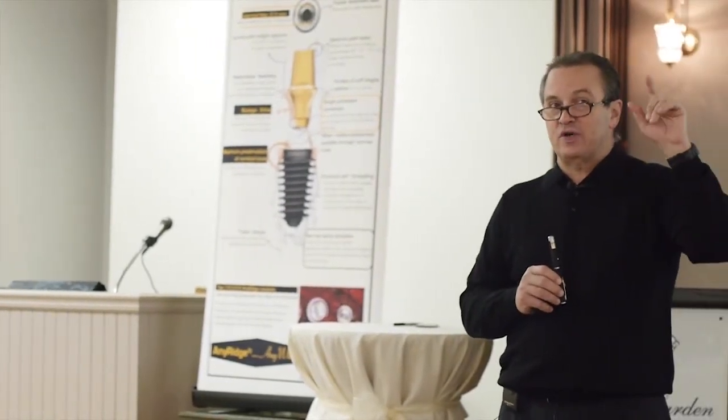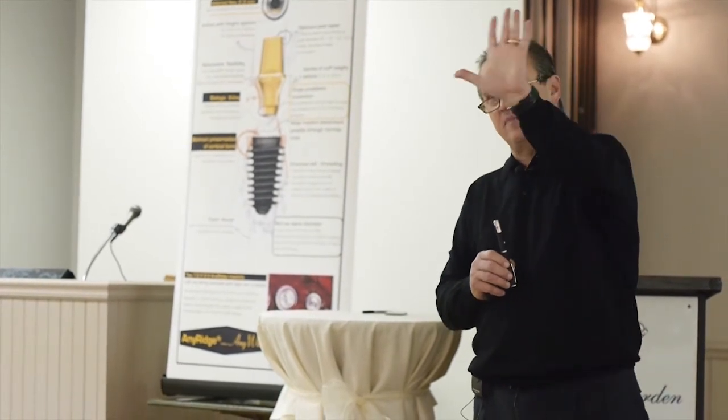It's a drill that they use in neurosurgery to go through the cranium, and when it's drilling, the particles go in front of the bit so that you wind up not perforating the meninges, or in our case, the antral membrane. And I've had good luck using those things. I really like them. You familiar with that too? It's kind of the safest thing to do is to use those burrs.